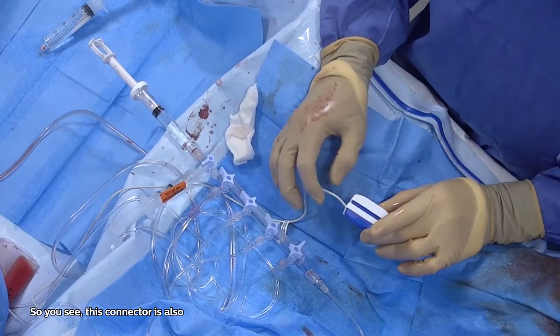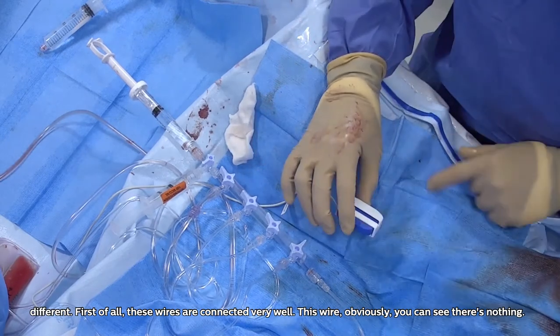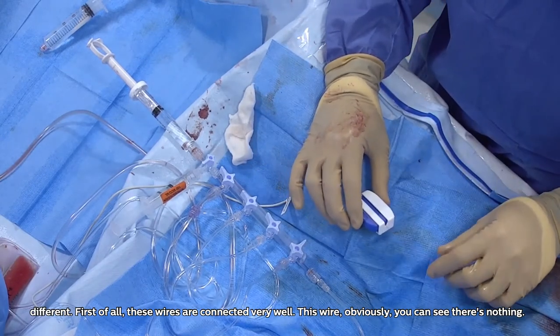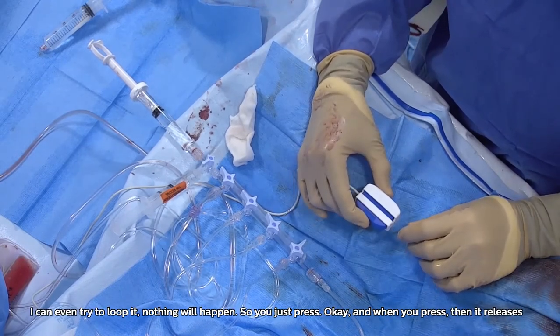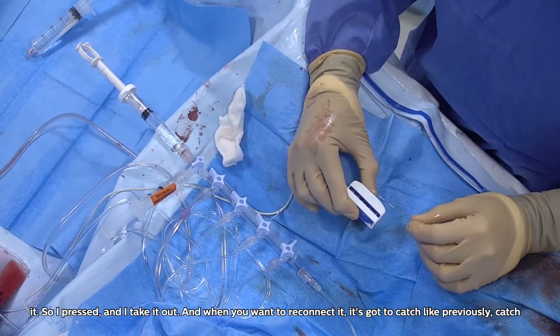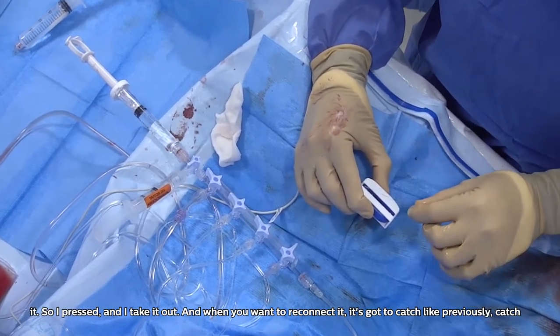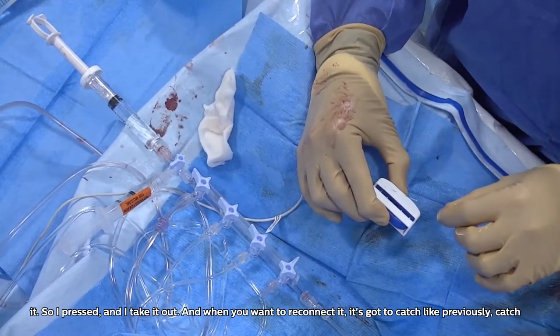So you see, this connector is also different. First of all, these wires are connected very well. This wire, obviously, you can see there's nothing. I can even try to loop it, and nothing will happen. So you just press, okay? When you press, then it releases it. So I pressed and I take it out, okay? And when you want to reconnect it, it's going to catch like previously, catch the distal.